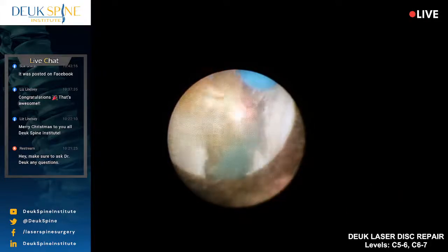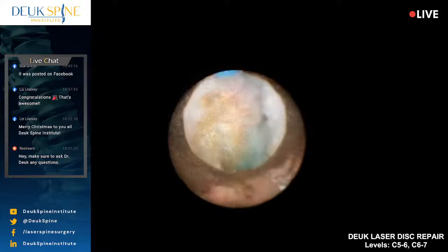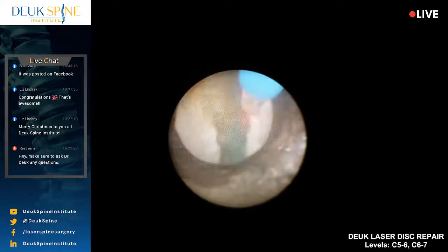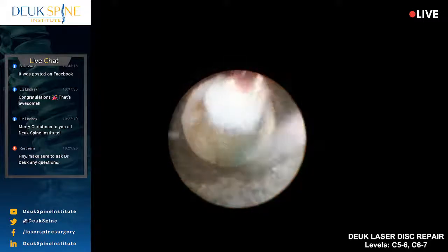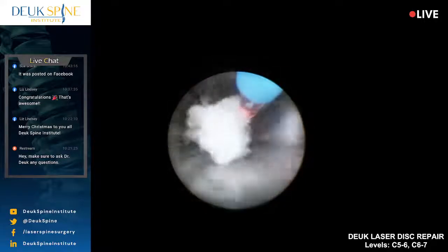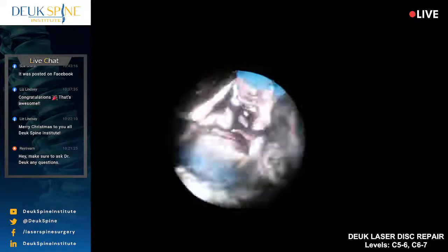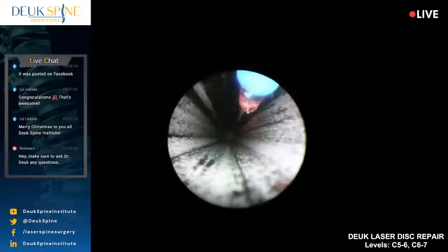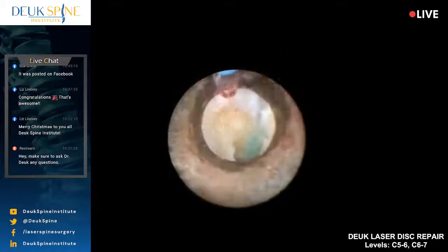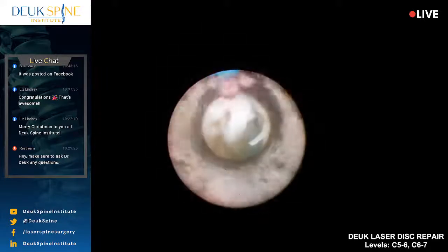Well, I hope you had an opportunity to see the video animation that we created. That was created by Zach when Zach was working for us. And I think it's a phenomenal explanation of what we do here. You can see that we make a small incision in the skin. We basically use a little tube to get down to the back of the disc where the problem is. And that way we can preserve the front of the disc so that we're not removing the front of the disc. We're only removing the little thing in the back causing all the pain and symptoms, which is the herniation and annular tear. There's another herniation right there.